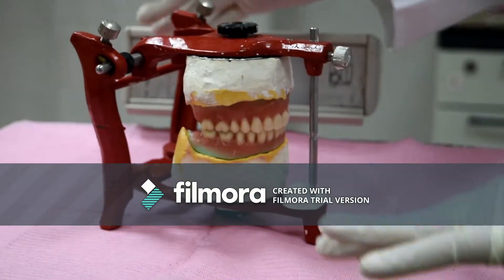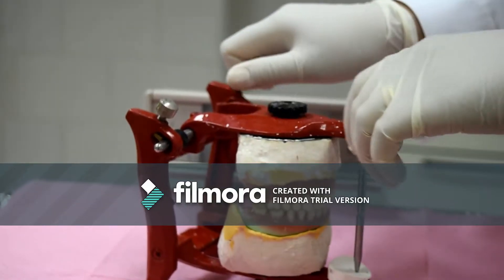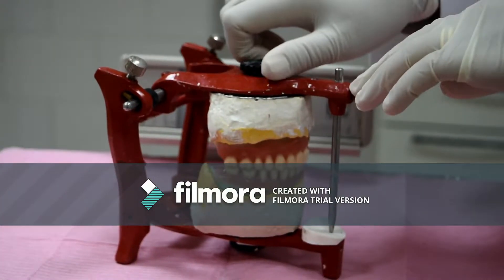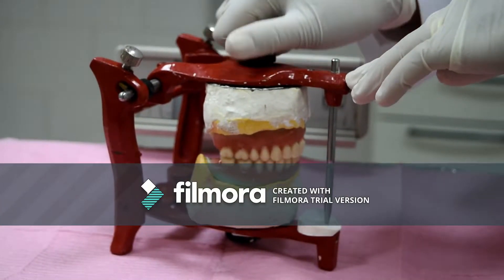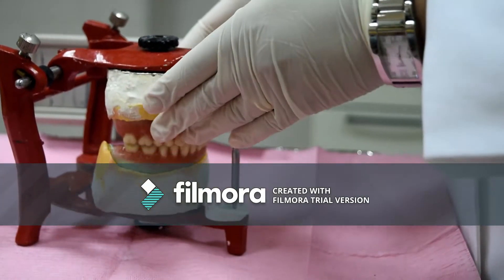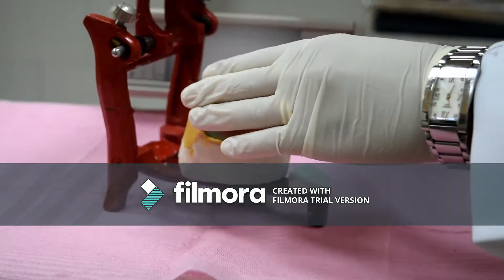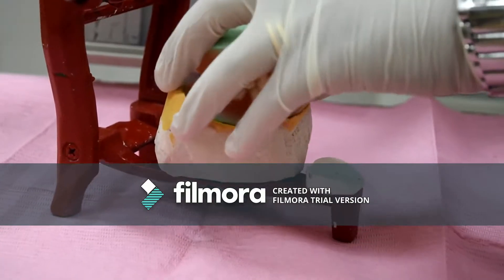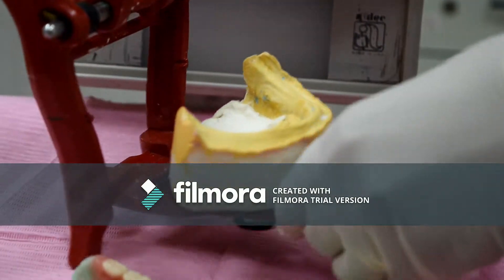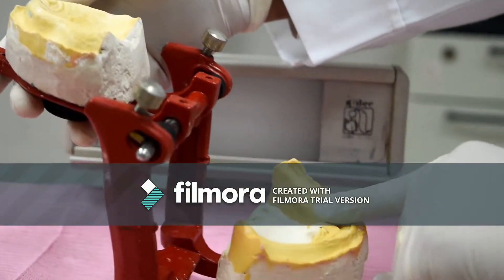Regarding the articulator, you have to check the tightened screws — it has to be firmly tightened. The mounting rings should be in their proper position and correctly screwed. The incisal pins should be in their correct position and the try-in denture bases in their proper position. The cast should be free from any wax, any scratches, and any undercuts should be blocked.